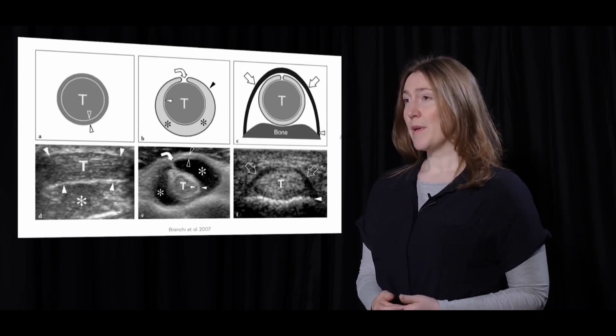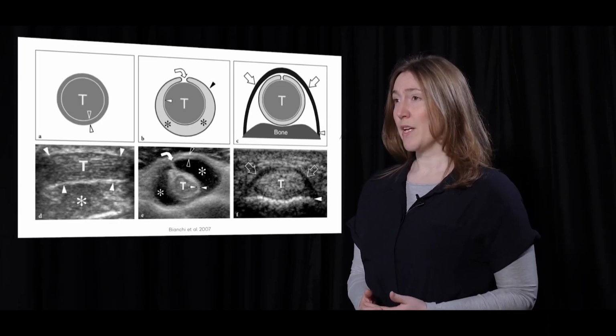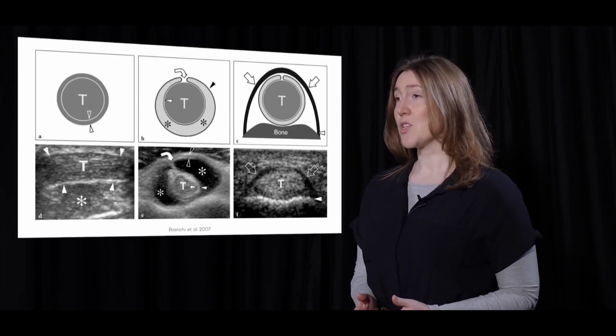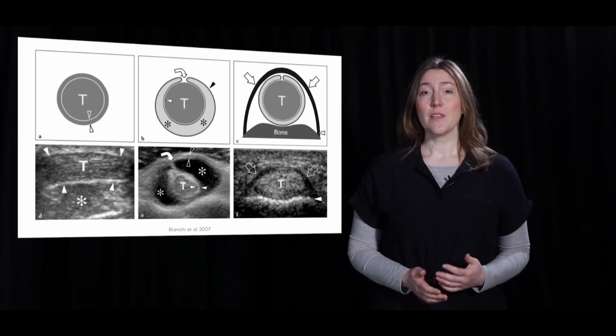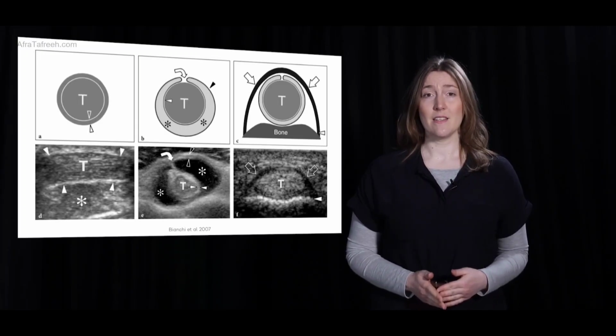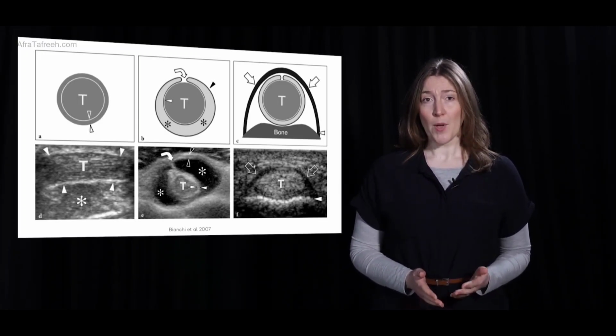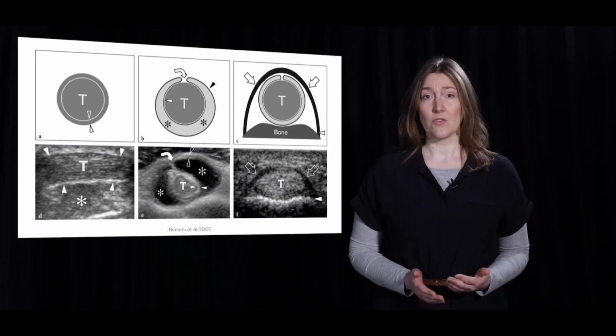It shows the normal appearance of an annular pulley and retinaculum, which prevents bowstringing of the underlying tendons during flexion of the fingers. Note that the superficial portion of the pulleys has a hyperechoic fibrillar appearance due to the perpendicular incidence of the ultrasound beam, whereas its lateral portions are hypoechoic as a result of anisotropy.